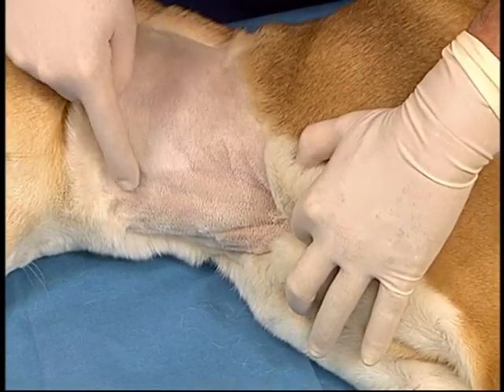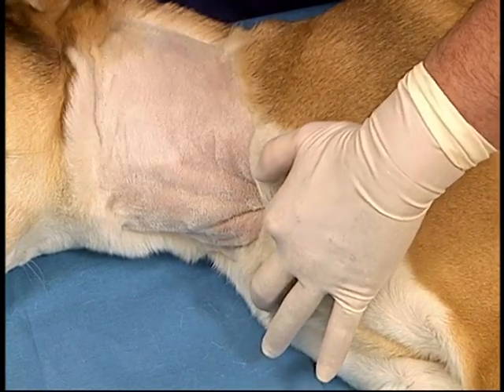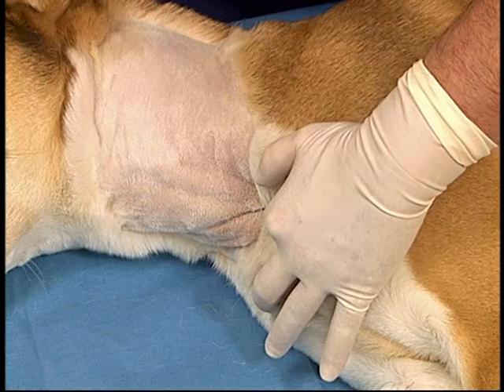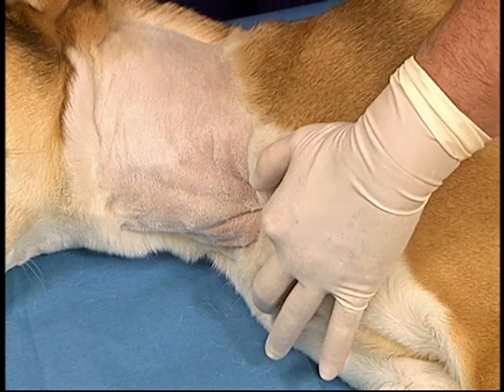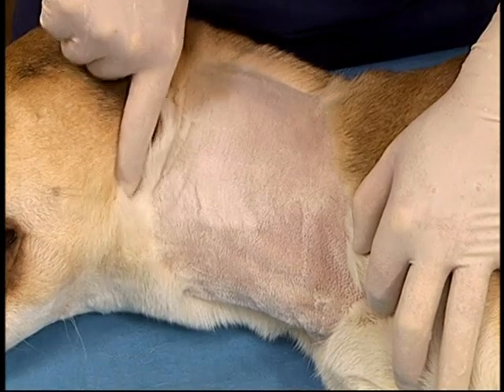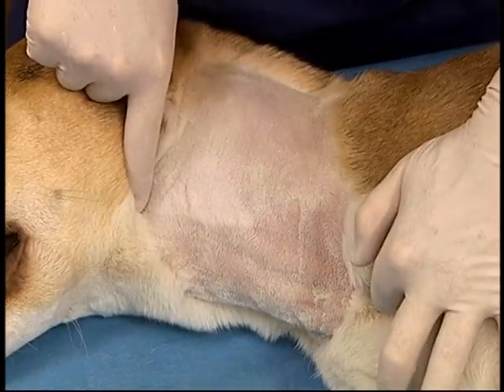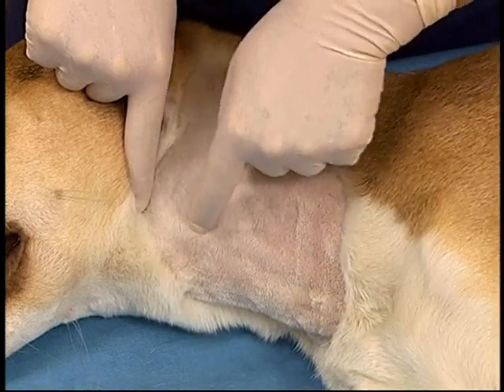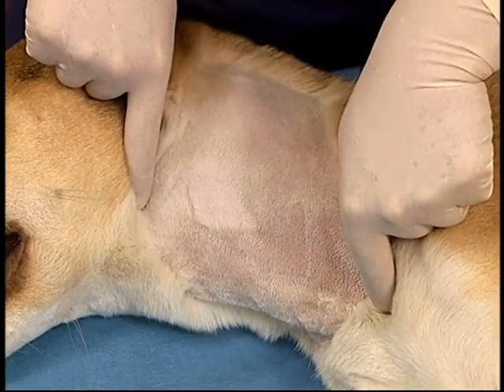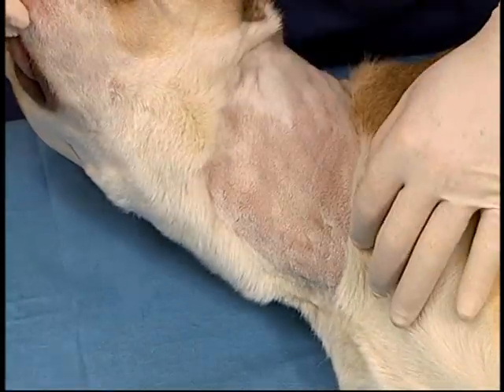When holding off the jugular vein, care should be taken to ensure that the index finger depresses directly into the thoracic inlet rather than retracting the skin caudally at the same time, which will flatten the vessel. The jugular vein runs from the angle of the mandible to the thoracic inlet in a straight line. This location is maintained no matter what position the animal's head is in.